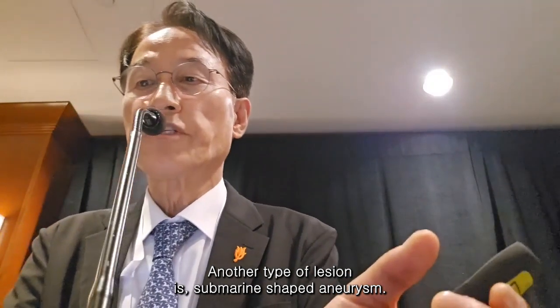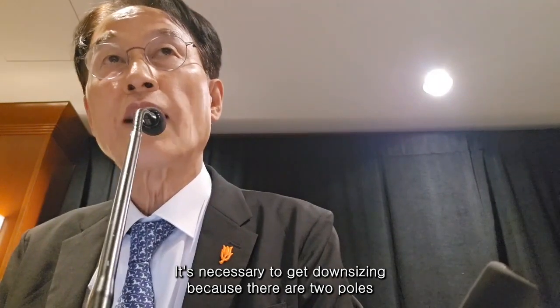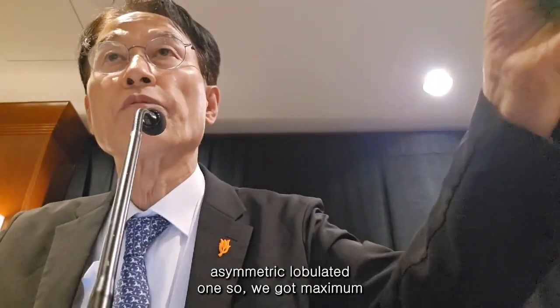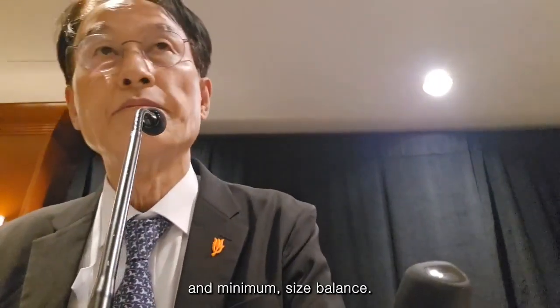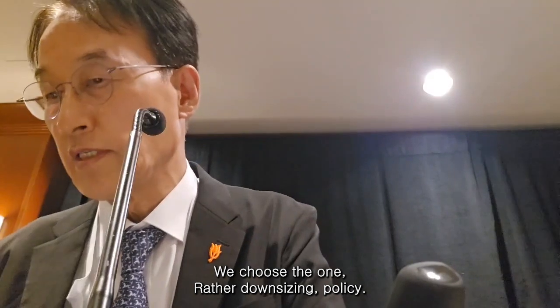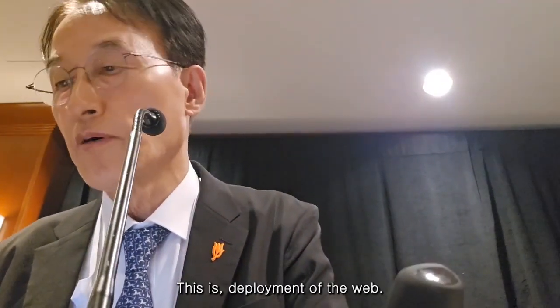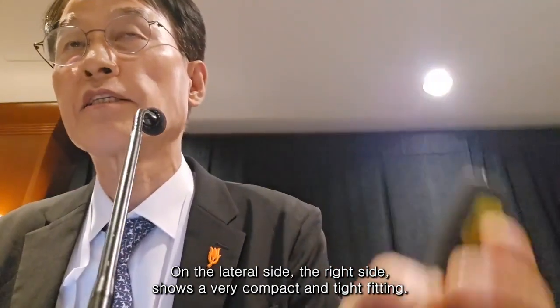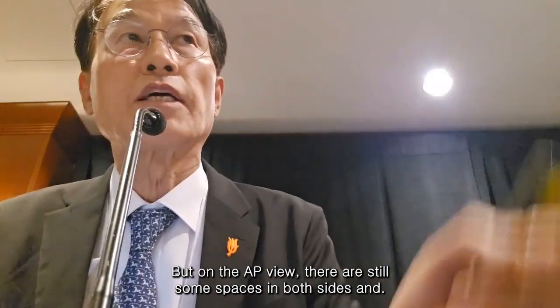It's a very specific web characteristic. Another type of lesion is a submarine-shaped aneurysm, maybe sweet potato shaped. It's necessary to downsize because there are 2 poles, asymmetric or lobulated. So we got the maximum and minimum size balance, and we chose the rather downsizing policy. This is the deployment of the web. On the lateral side, the right side shows a very compact, tight fitting, but on the AP view, there are still some spaces on both sides of the end.